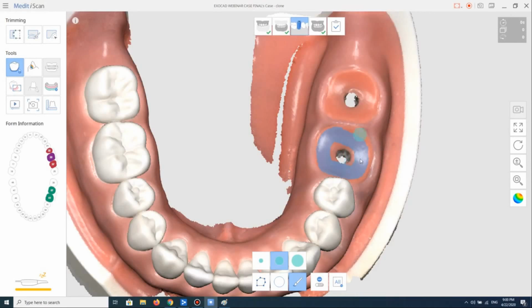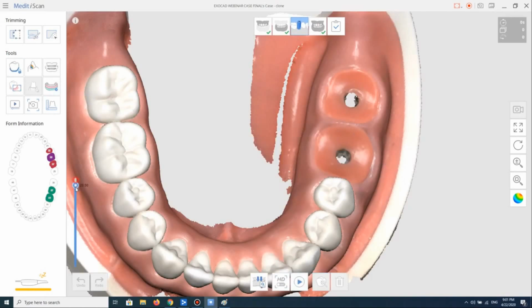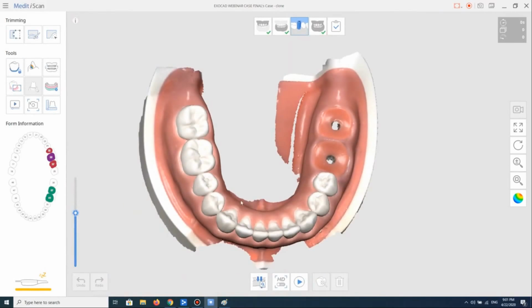In case you have a situation like this, with one implant after the other, always make sure, before you proceed to the next one, especially if you have only one scan body, to first lock your first scan body scan with the lock area and then perform the next one. Here I don't need to do that, so I will just press minus here. I will paint again and make that disappear. So let's begin. I will minimize my scanning depth here. I don't need it like that.